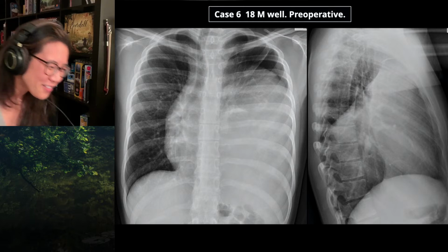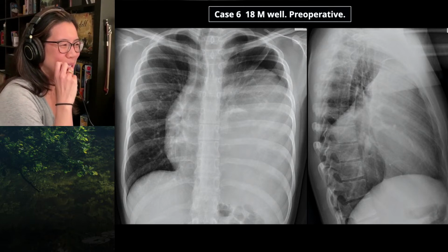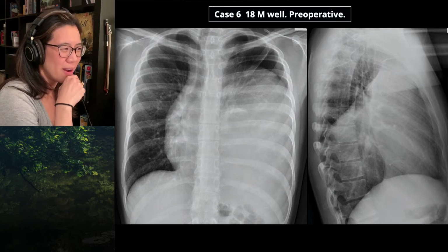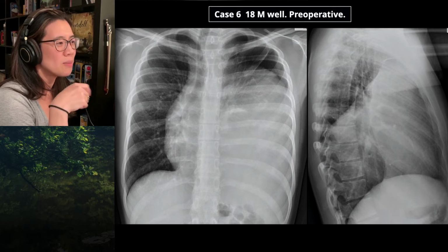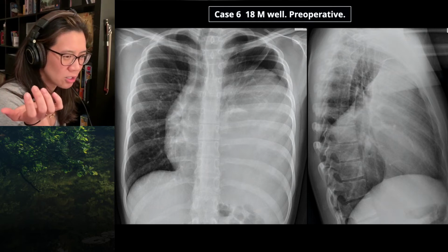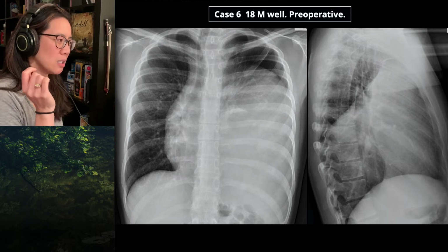Okay. 2 views of the chest in an 18-year-old man for preoperative assessment demonstrates abnormality of the left hemithorax, characterized by a mass that has a well-circumscribed superior margin and a poorly defined lateral and inferior margin with associated mass effect with displacement of the heart to the right.